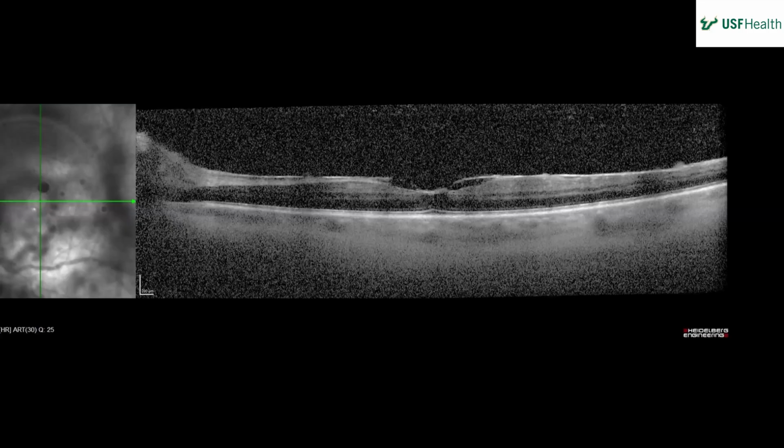It'd be picking up some of that vitreous debris. All right, so this is an OCT MAC. You see, it looks like there's some sort of epiretinal membrane on the surface over the fovea, as well as the vitreous has quite a bit of debris in it, or cells.